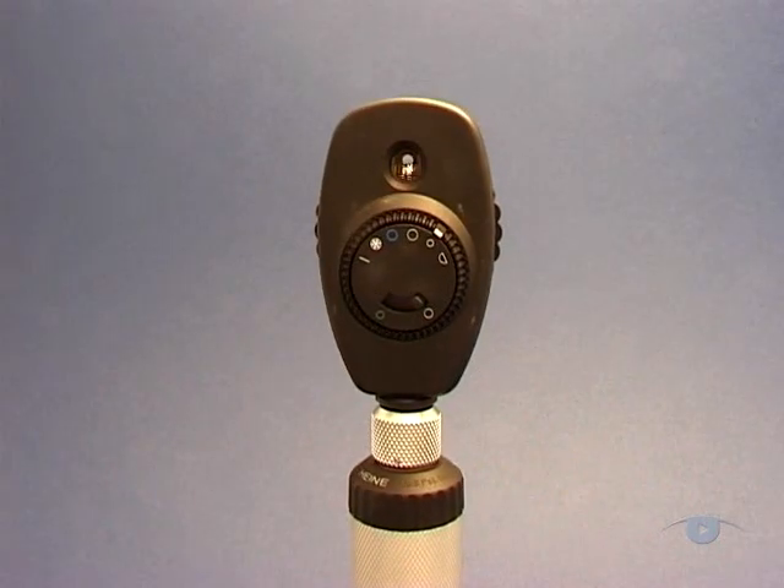So that just about completes the basic tutorial on the use of the direct ophthalmoscope. But before we wrap it up, we'll show you some pathology for your interest.